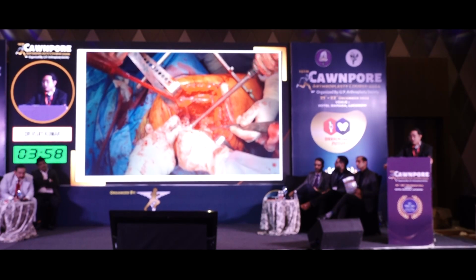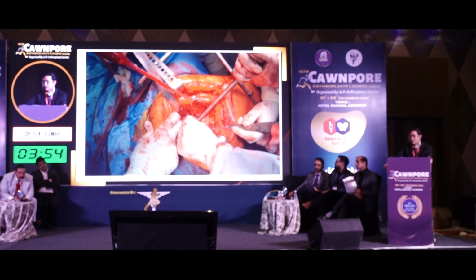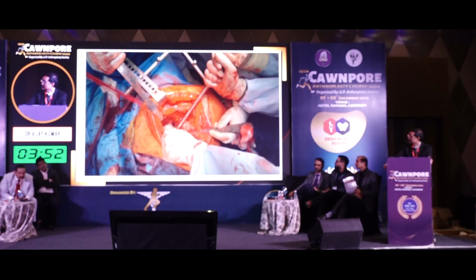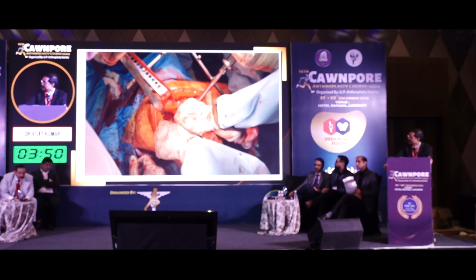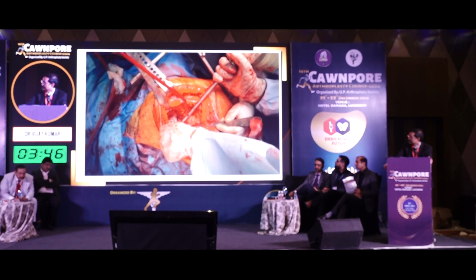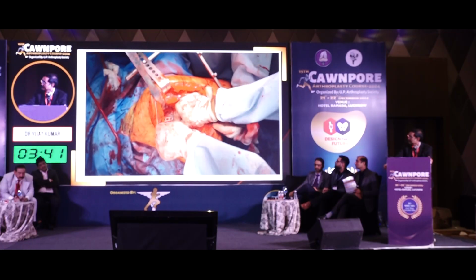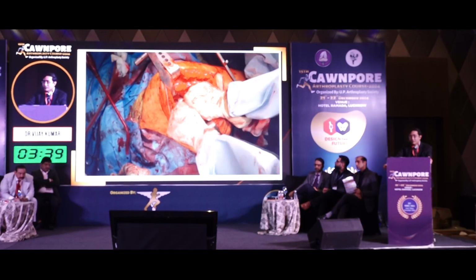If you're using a graft, femoral head graft, it's very wise to support it with some sort of plate or a cage if it's a revision situation. Graft alone would not be very successful. And once you have some amount of stability, most of these revision cases with defects, the cup usually is put in with hand most of the time.